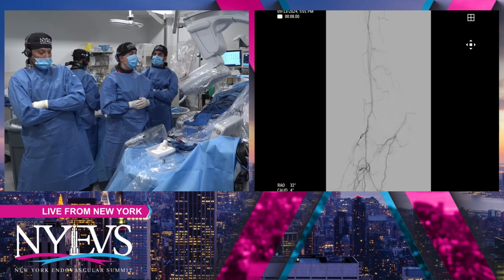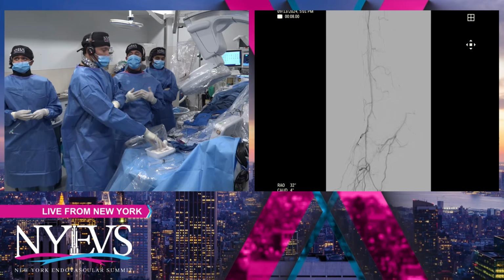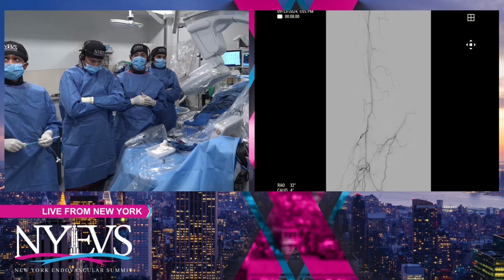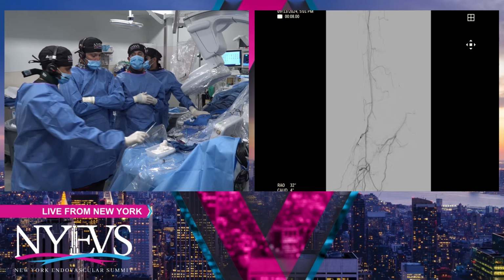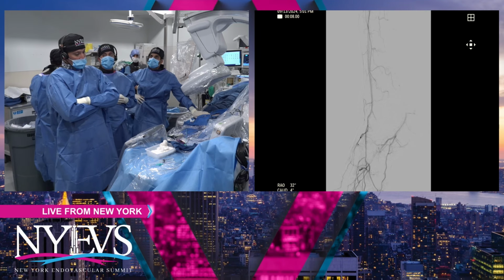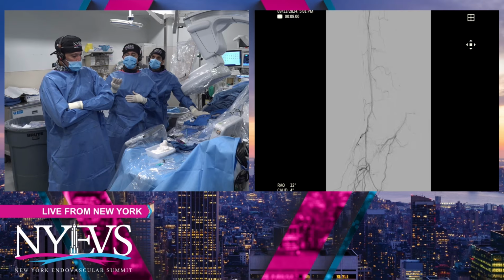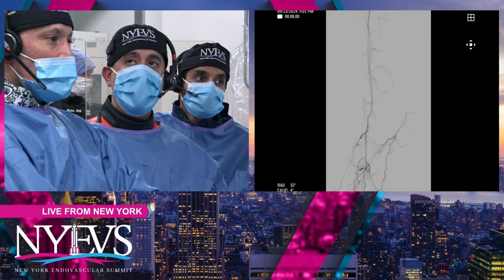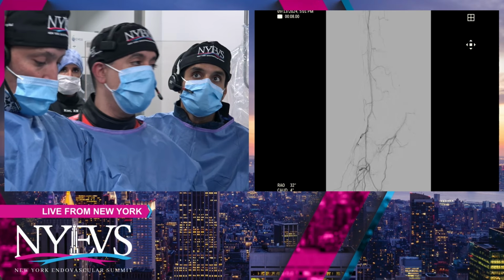So I think we did achieve good enough flow all the way down for a rest pain lady who's presenting with significant ISR, and the lesions we identified, hopefully we treated to the best of our technology available. I think this should definitely help her in the long run. Of course, we're going to follow up in clinic, make sure she does well, and hopefully we don't have a recurrence. And if we do, then we have to talk about other options like you talked about, whether it's a true surgical bypass or a detour like Kumar was talking about, as other alternate strategies. Any comments from the panel will be highly appreciated.